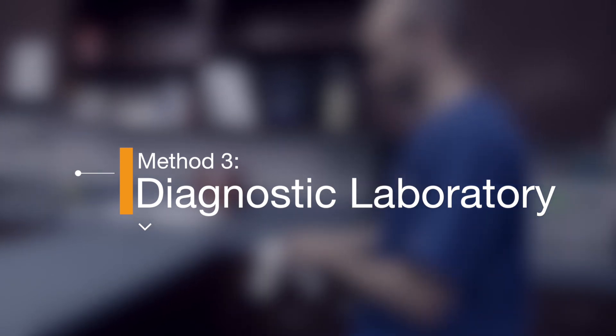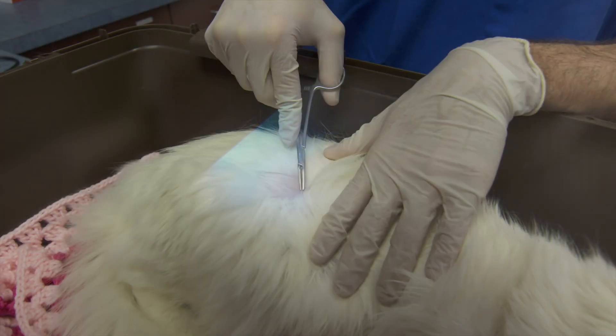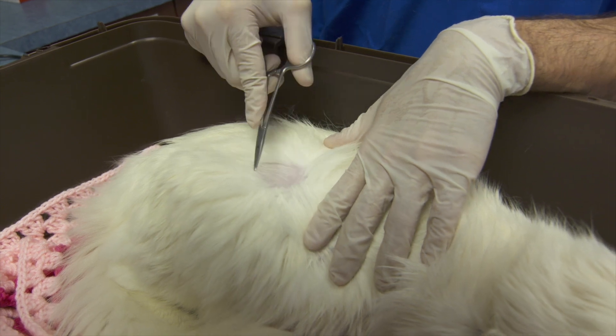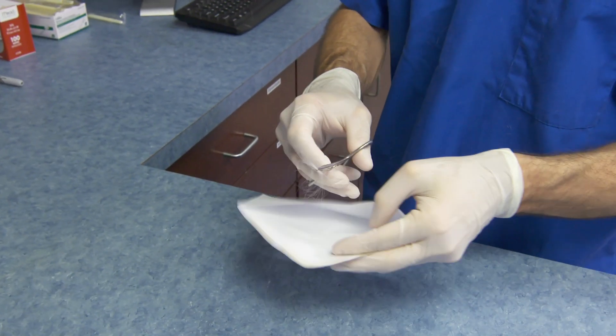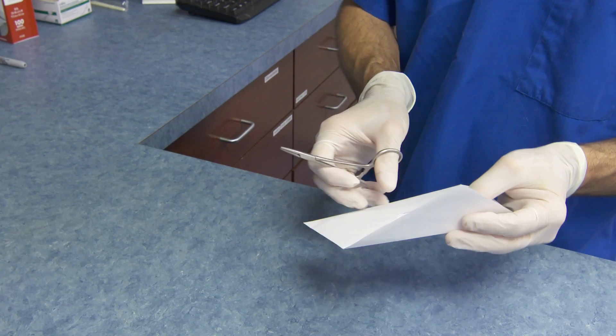Method 3: Diagnostic Laboratory. To obtain samples for fungal culture, gently pluck hairs that fluoresce under Wood's lamp examination or those from the edge of suspicious lesions. Collect a minimum of 10 to 20 hairs and place them into a paper envelope, labeled with the animal's ID number and date of collection.